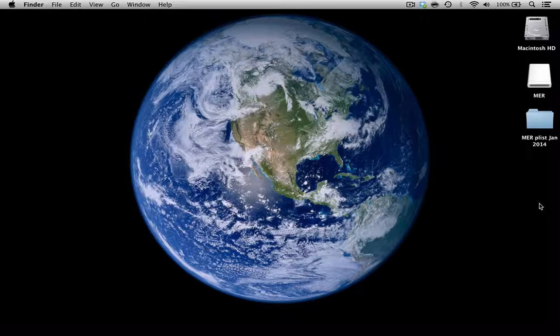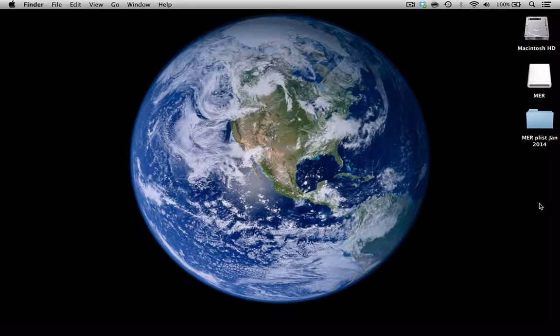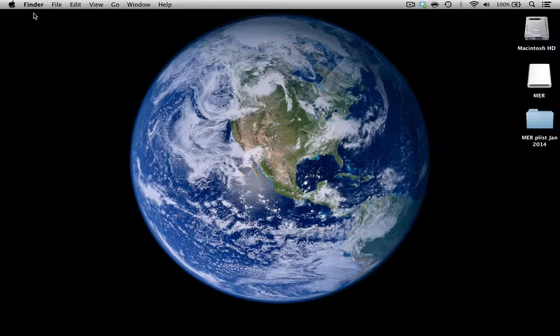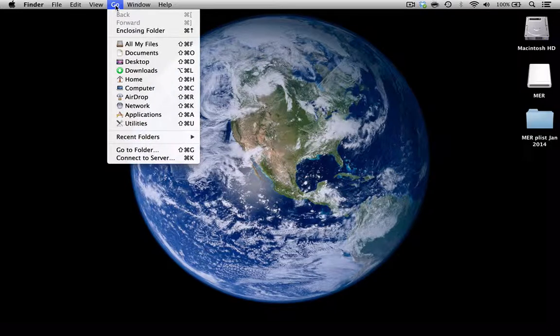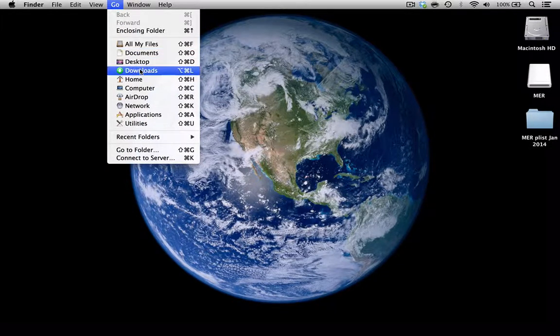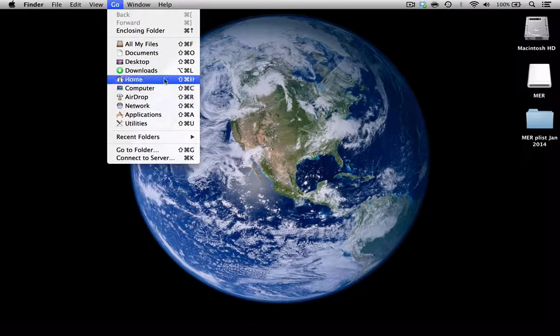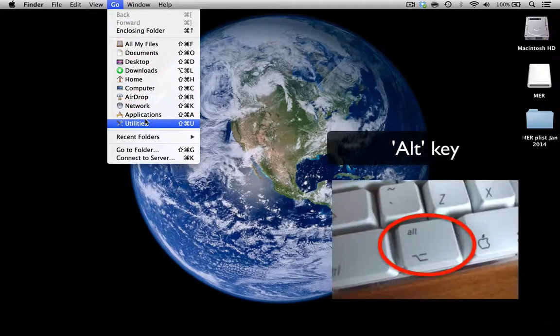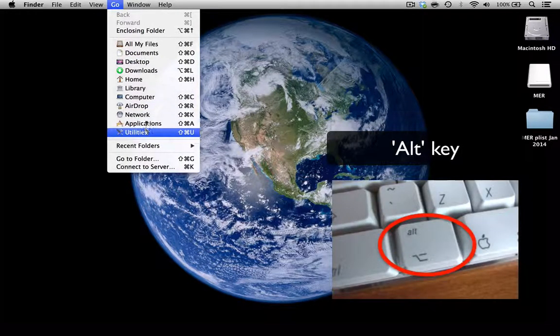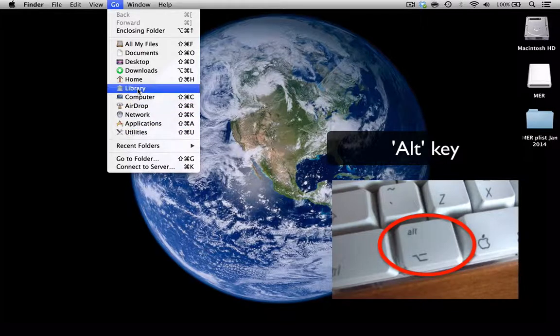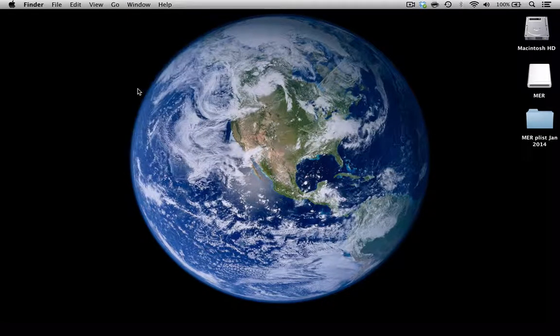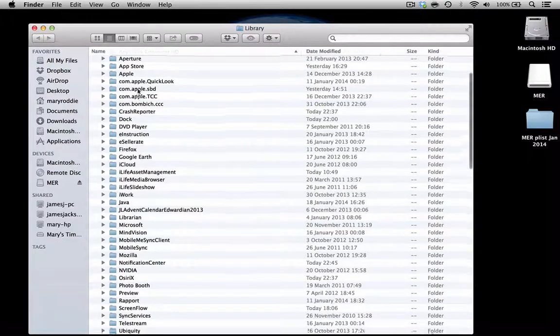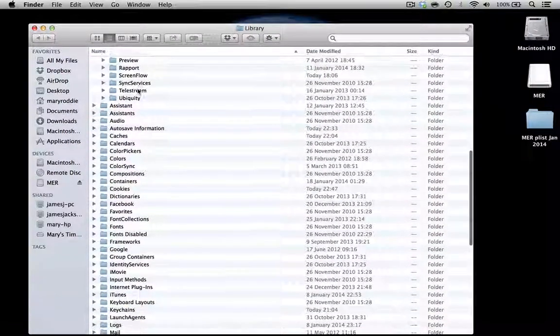Many of you may be familiar with where your OSirX preferences are hidden on your computer, but for those of you who aren't, what you need to do is look at your Finder menu and under the Go title look at all the files underneath there. The file you're looking for is the Library file, but it won't appear until you press the Alt key. When you press the Alt key, you can click Library and it will open.